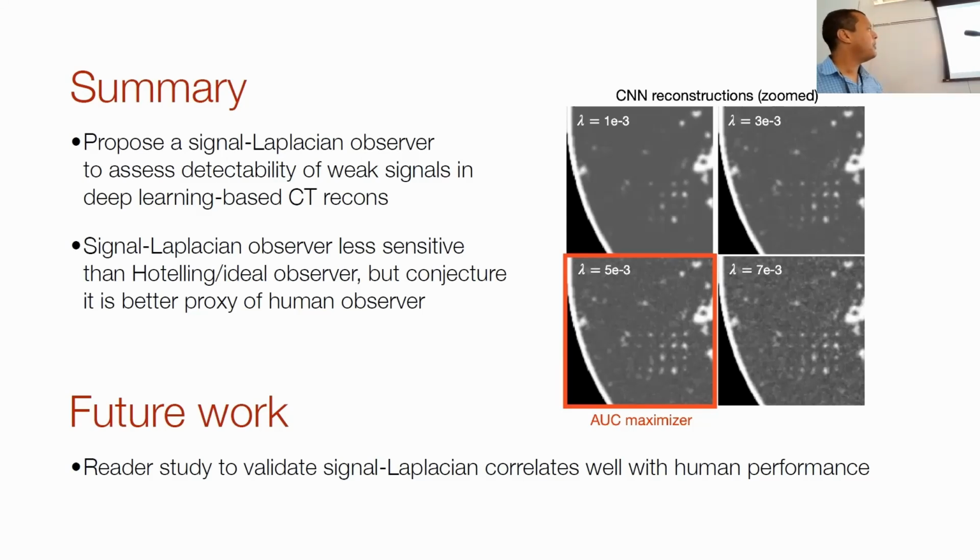So basically, just showing you preliminary results for using the signal-Laplacian to tune image reconstruction parameters, but we obviously need to do more work and do reader studies to see if this can actually be used as a surrogate for human performance.